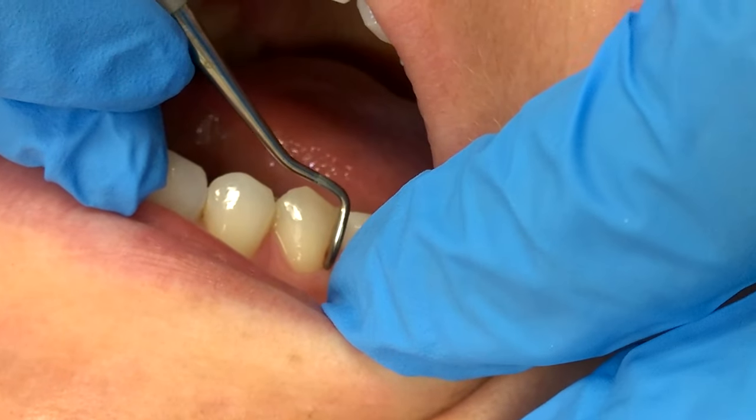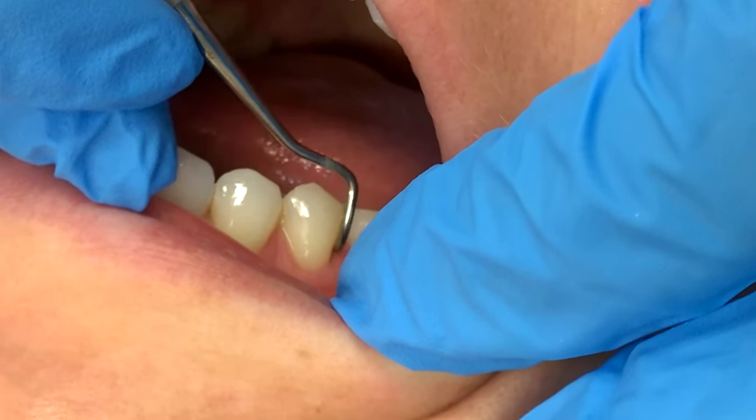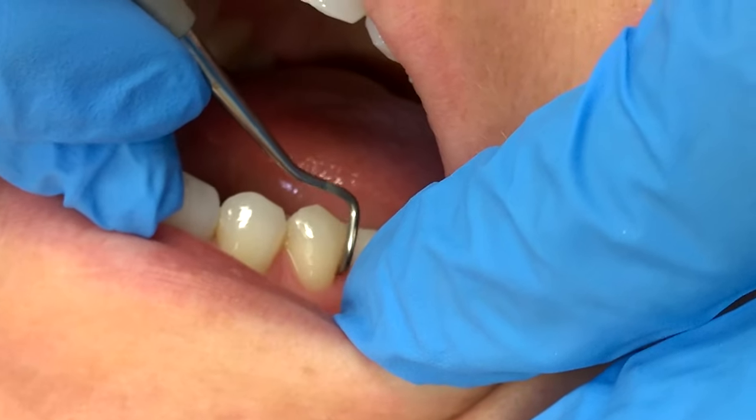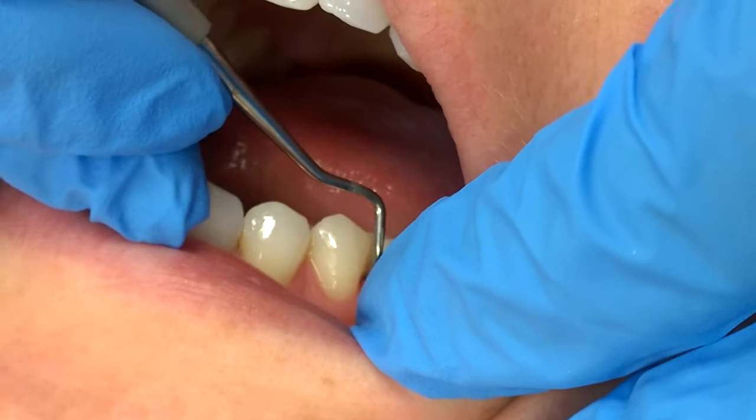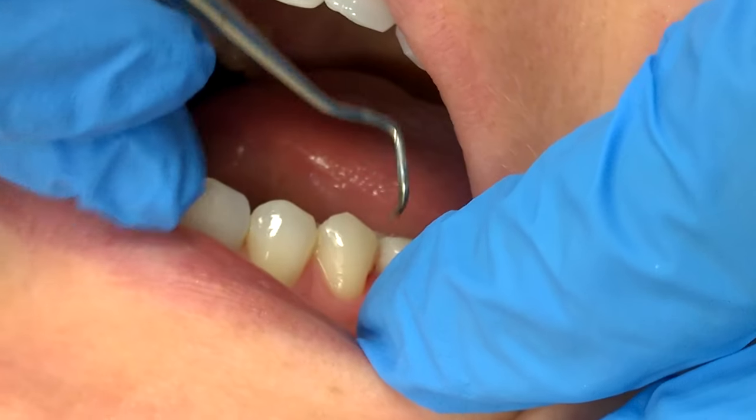So to use this, you're going to start just like your regular instruments, right at your line angle. Come in and do a few exploratory strokes until you feel like all the calculus is gone. It's got a little overhang right there.